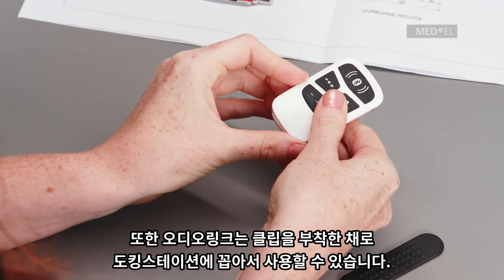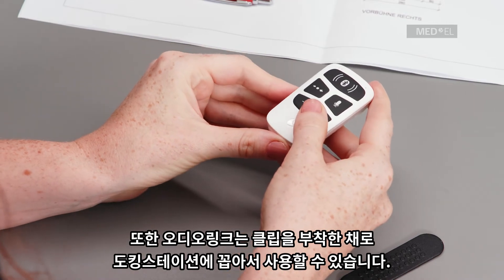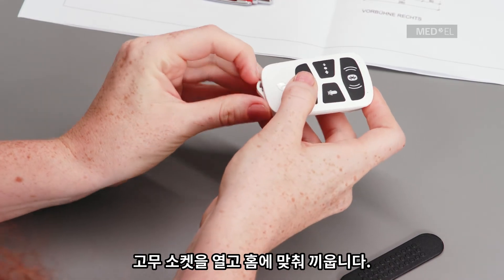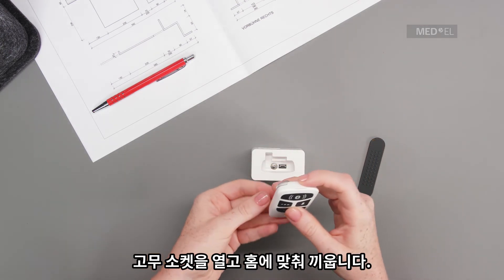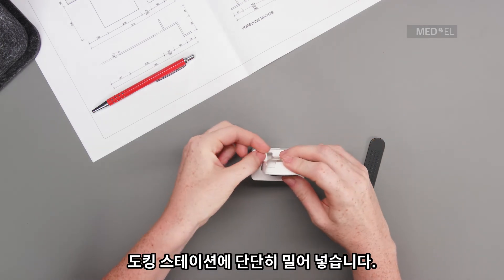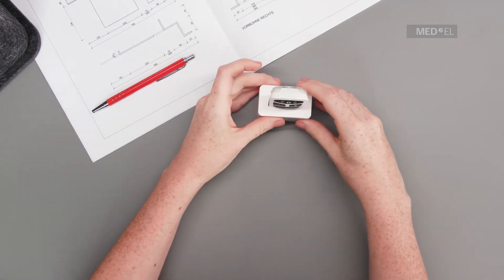Alternatively, AudioLink can be used with the docking station, even with the clip still on. Open the rubber socket and make sure it sits in its recess. Push it down firmly into the docking station.